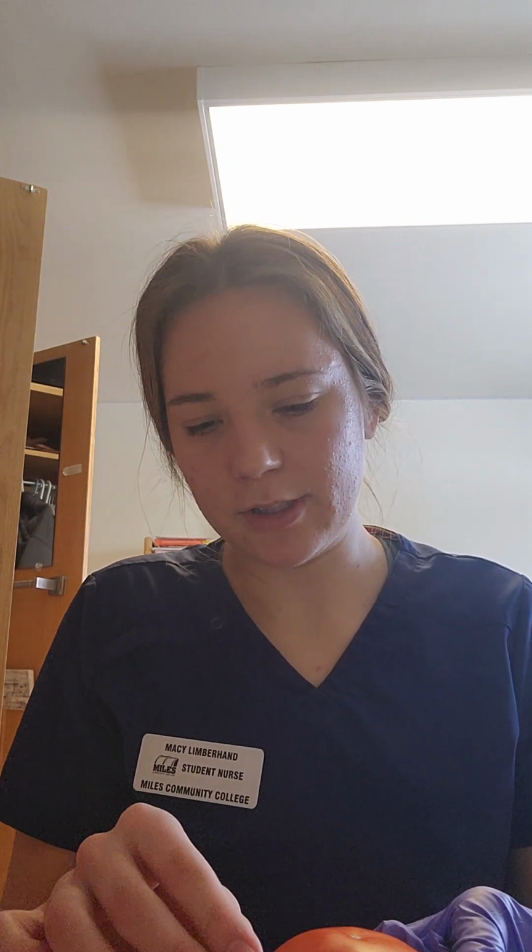And I'm going to recap. Actually, I wouldn't recap. I lied. I would put this directly into a sharps container. Now, I am going to just pat him dry because it might have this little drainage. He's a tomato, so he doesn't take it very well.